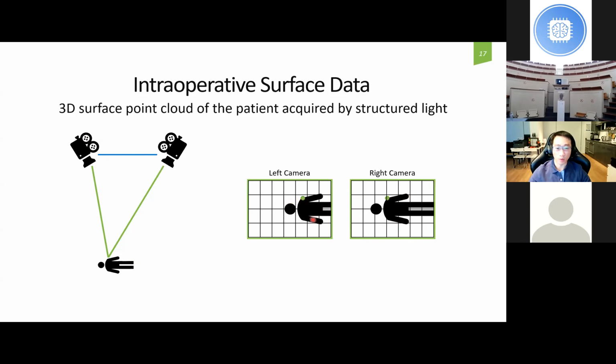And you do it for every single point in the image, and you get a 3D point cloud coming out of it. There are different ways of doing imaging. Currently we use something called structured light, where the projector system allows us to encode the surgical field. But if you don't have structured light, here's another problem where machine learning can help us: stereo matching using machine learning.